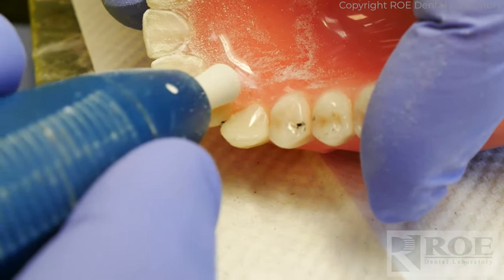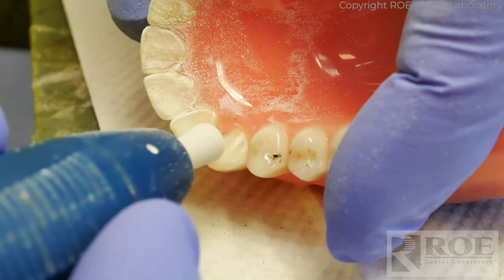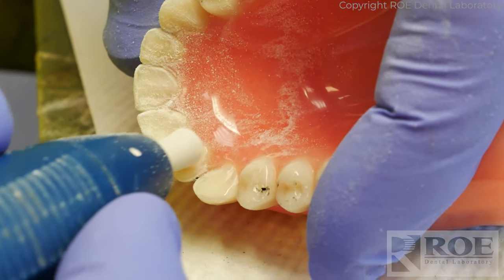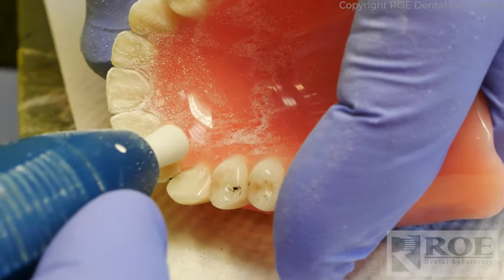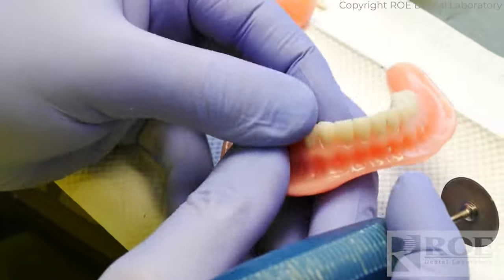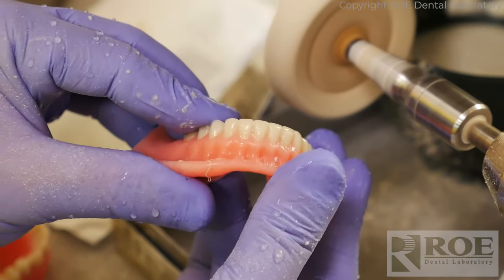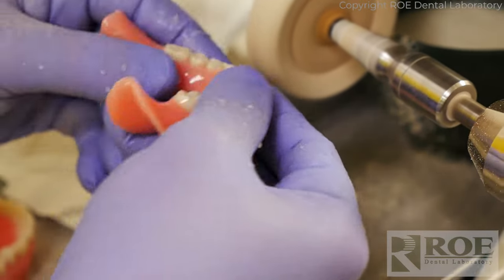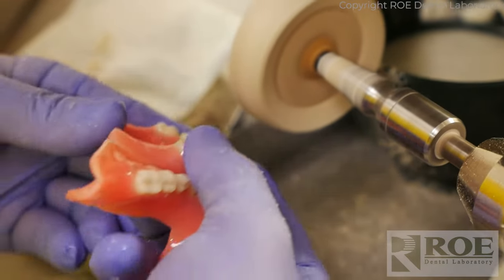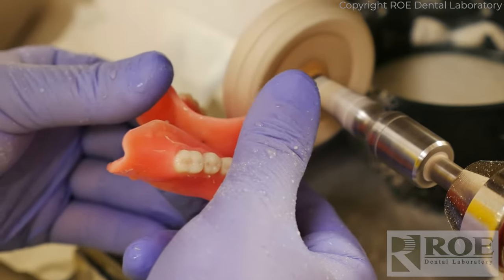Her bite is so tight in the front, so I made the adjustments. The last ten percent of the adjustments are actually going to be made using the polish — you go where you think you need to go, about minus five percent, and then you just let the polish do the rest. Now you see more separation — they look kind of blocky. The polish should make them smooth. They look more human, you see that. Then you go from behind to remove the rough edges. We don't want to remove the beautiful anatomy that Alan and his team put in there, so just a little bit of that.